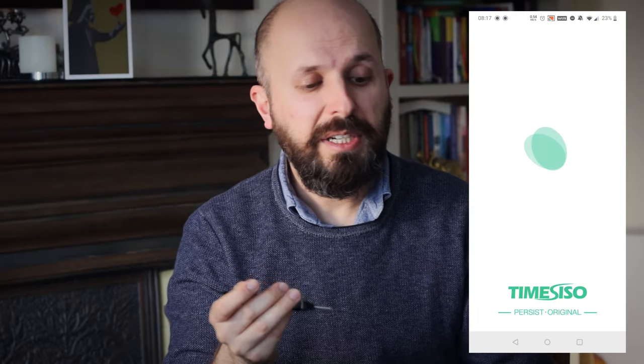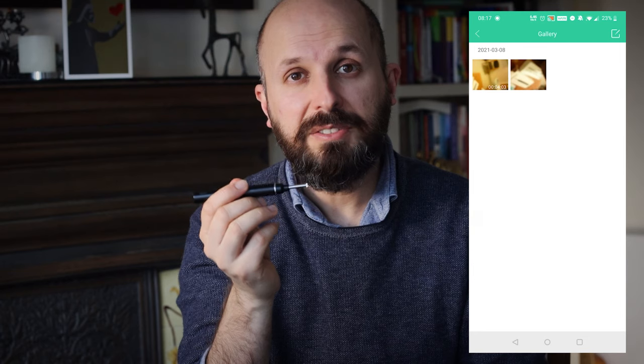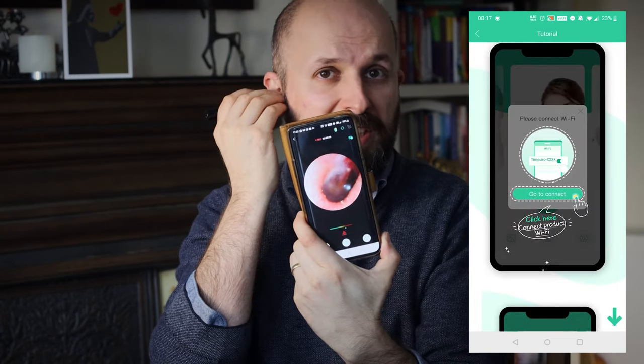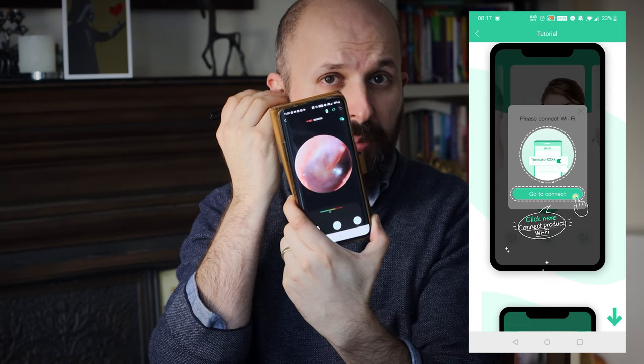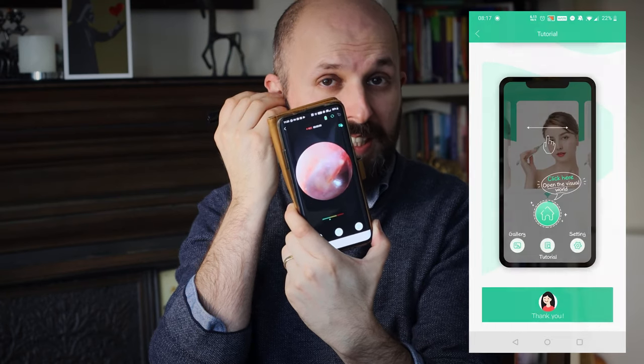Installing these devices is quite quick. All you have to do is connect your phone's Wi-Fi to the same Wi-Fi that this device gives out. Once you're connected you get a screen view from the camera end — you might be able to see my eardrum there. It's not a bad picture. However, I can't get that picture when the paddle is on it — I simply can't get it into my ear.